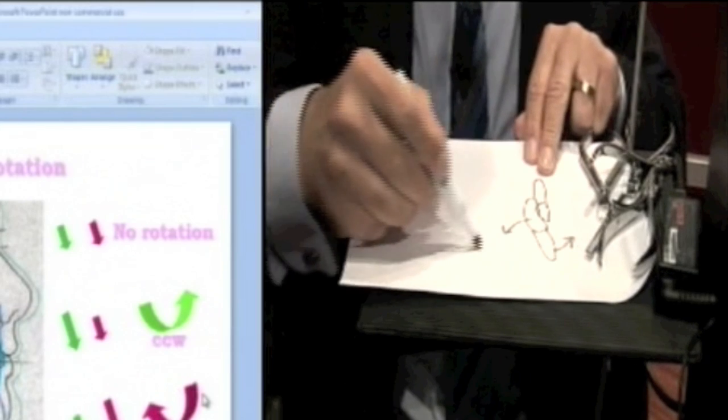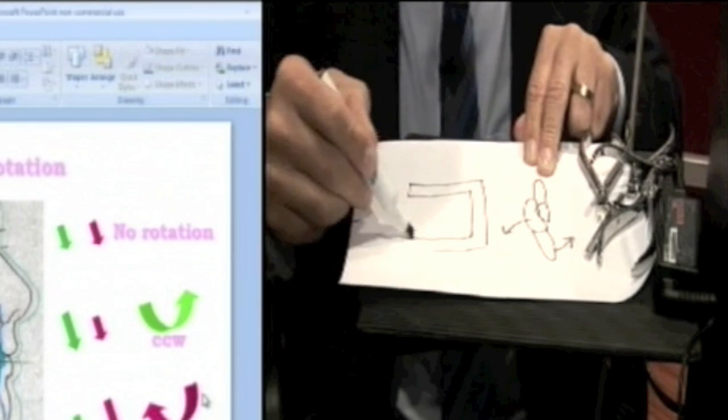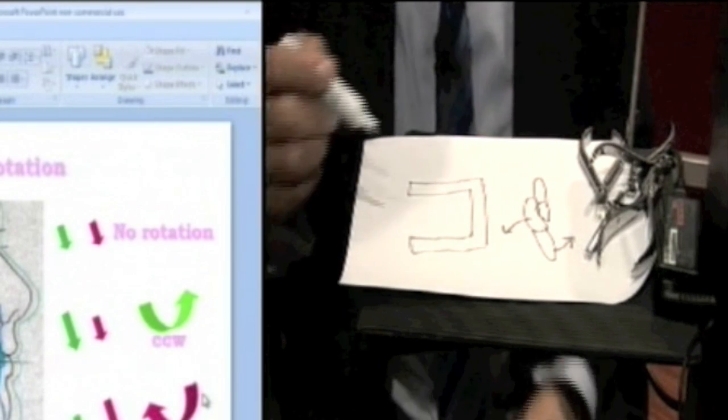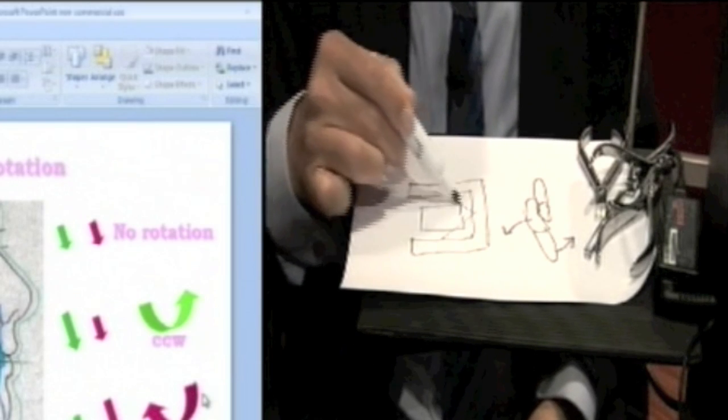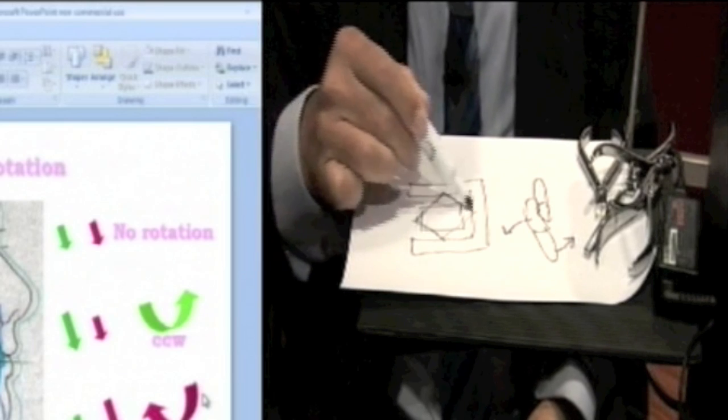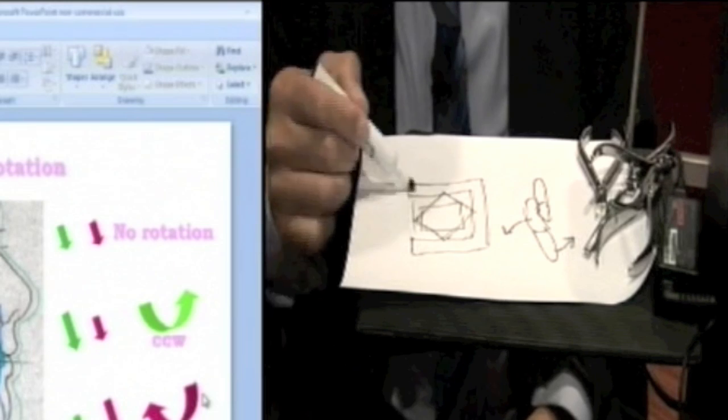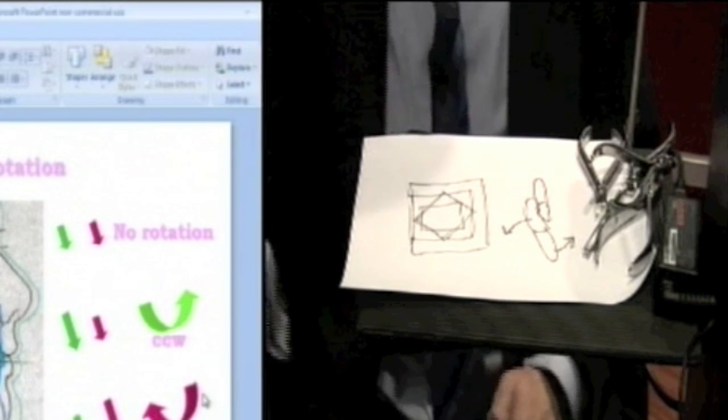So what it means is if this is your bracket, rather than the wire going in like this, the wire will now go in like that. And when the wire goes in like that and you close the gate, it's going to express the torque.